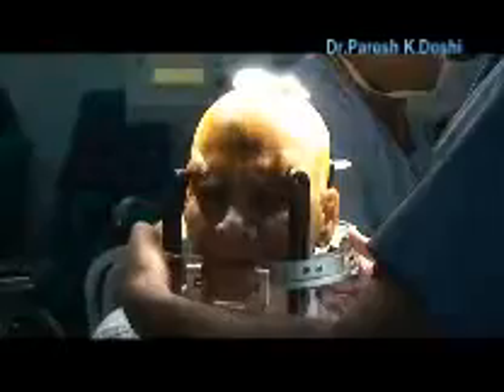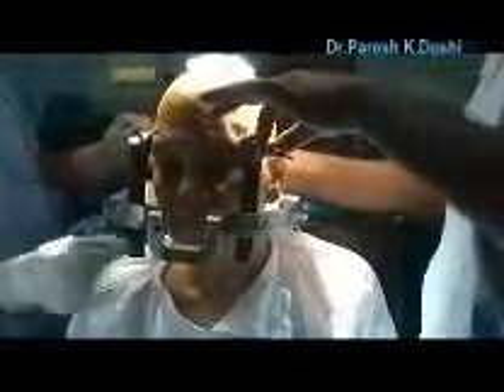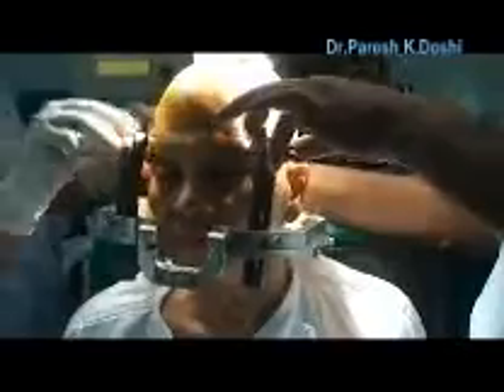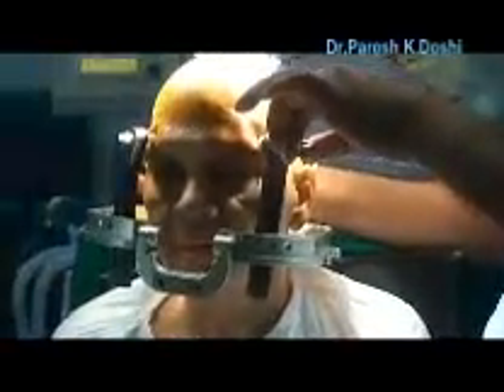This is the only painful bit of the surgery. Otherwise, after this, there will be a lot of excitement. Two-finger type. Elderly patient, osteoporotic — you have to be careful not to over-distract.